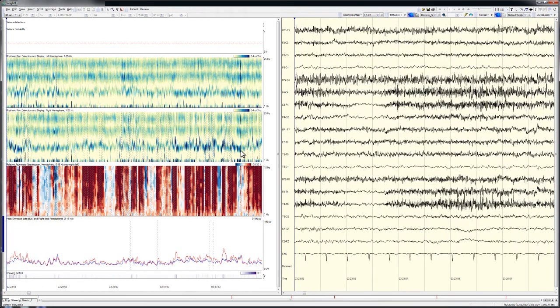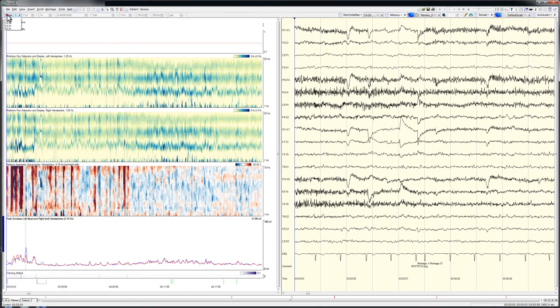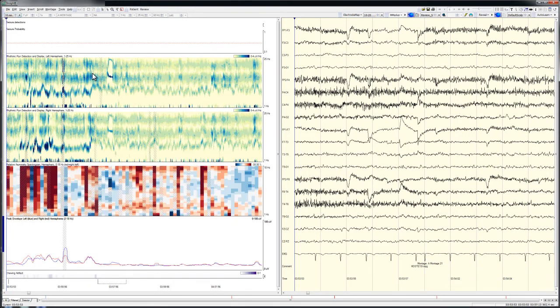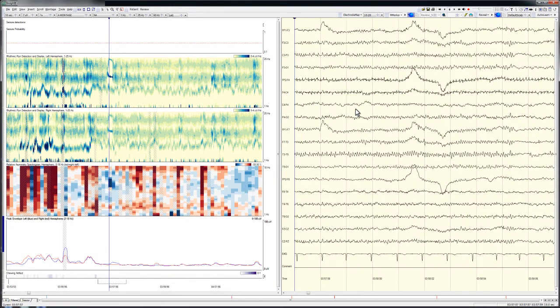Then a brief but clear-cut discontinuity is evident in the alpha and beta regions of the left hemispheric rhythmicity graph. Briefly zooming into a 10-minute time window allows better visualization of this unique change. The alpha band narrows and becomes much darker blue, indicating a substantial increase in a specific rhythmic alpha pattern. Though brief, this pattern shows some downward slope signifying an evolution in frequency.